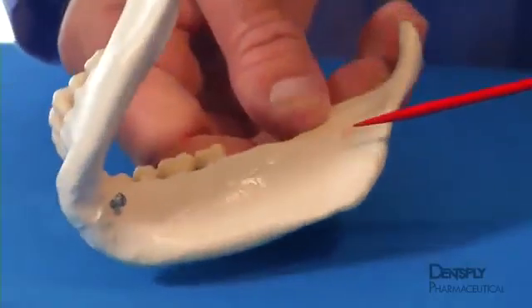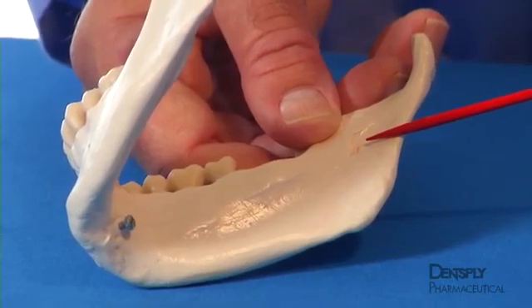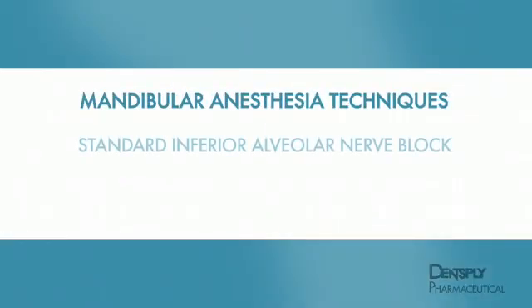However, the inferior alveolar nerve is accessible before it enters the body of the ramus through the mandibular foramen. Deposition of local anesthesia in this area will produce conduction blockade. In this program, we will examine the three most commonly used injection techniques for mandibular anesthesia: the standard or classical inferior alveolar nerve block, the Gow-Gates mandibular nerve block, and the closed mouth or Akinosi technique. Our goal in this video is to increase your success in achieving profound anesthesia of the mandible.